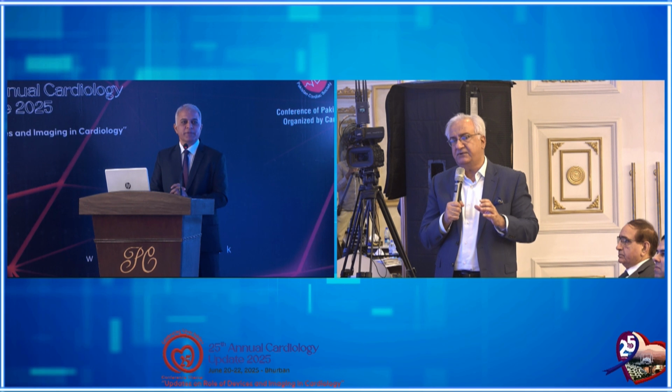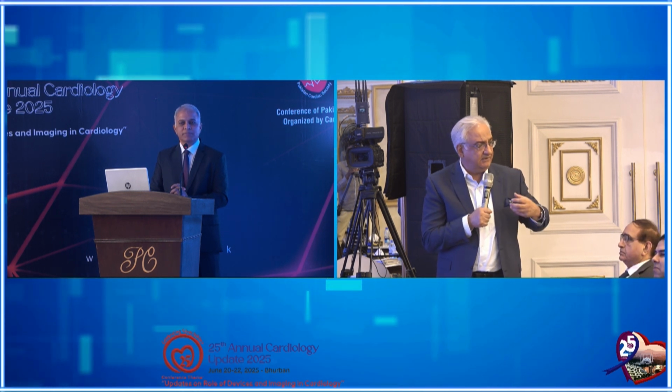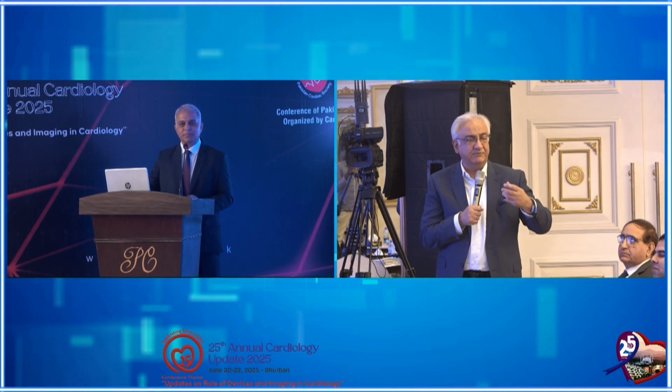For example, if you cannot recross a DK crush in your first jailed vessel, suppose you can't recross it in the circumflex, and you have a wire which is still jailed in the crushed circumflex, you open it up and turn it into a culotte. So in a bifurcation, one must always be ready to change the strategy because the patient may become unstable. You may not be able to complete a procedure. You may not be able to recross. Some of the side branch may become totally clotted.